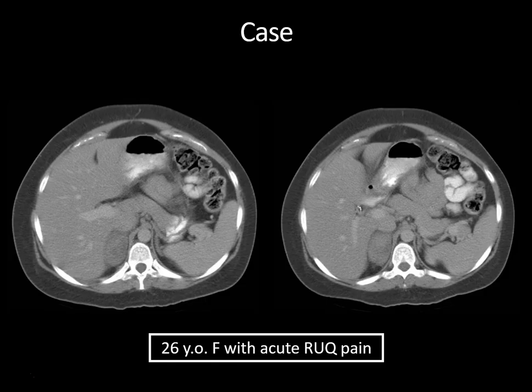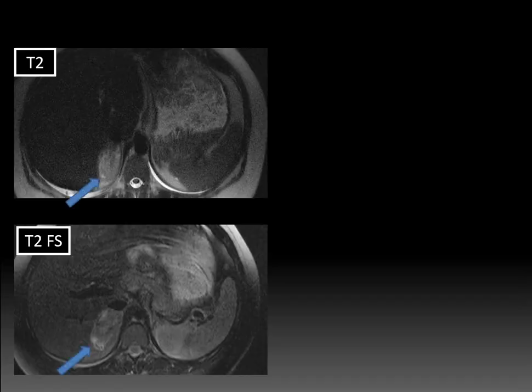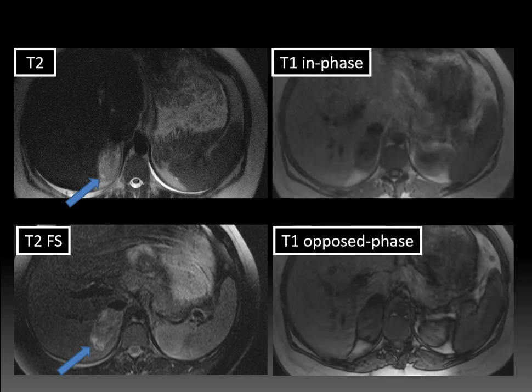Let's look at another case. This was a patient who came with acute right upper quadrant pain, and you can see that this CT scan shows a well-circumscribed ovoid heterogeneously hyperdense right adrenal mass. Looking at the MRI for this patient, there is a heterogeneously T2 hyperintense and hypointense right adrenal mass. The upper image is without fat suppression and the lower image has fat suppression. You can also see some trace pleural effusions. Looking at the T1 in-phase/opposed-phase chemical shift imaging series, this mass demonstrates no signal dropout — again not consistent with a lipid-rich adrenal adenoma.